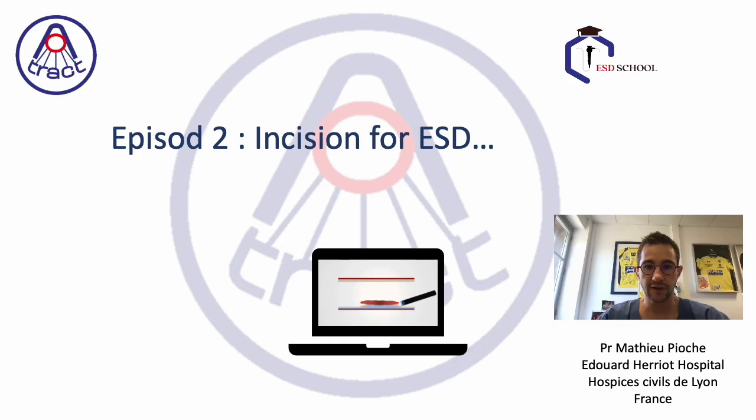Enjoy the video. Dear all, thank you very much for being with us for this second episode about incision in ESD. Now the aim will be to cut the mucosa and enter into the submucosa. And we will try to show you many tips and tricks to improve your skills to do this important step for ESD.